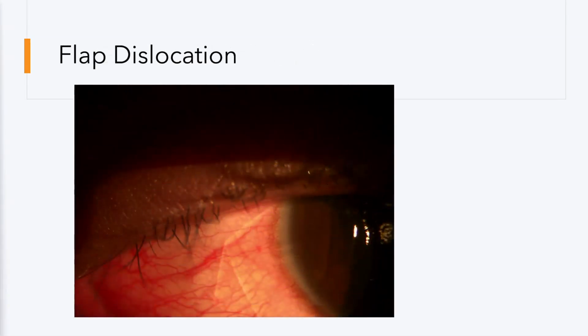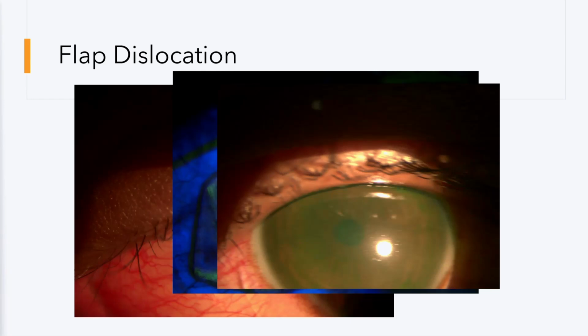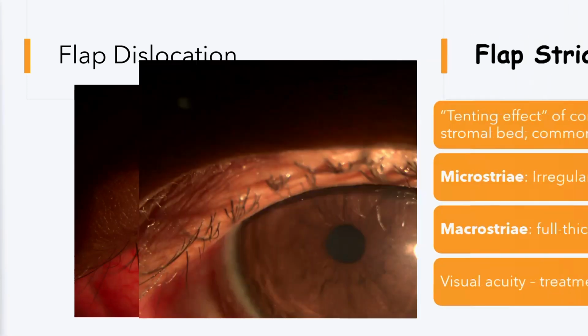This was one of the cases who came and said that he was having a lot of itching in the post-operative course. He rubbed his eyes so vigorously that the entire flap was lying on the conjunctiva and the stroma was absolutely exposed. So these are the cases where you need to reposit the flap, but if you are doing it just blindly, you may have an epithelial ingrowth coming in the post-operative times. So while repositing the flap, you need to be very careful of cleaning the stroma thoroughly, even applying MMC over it, and then repositing your flap. So you get a clean cut cornea like this.